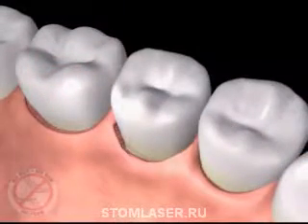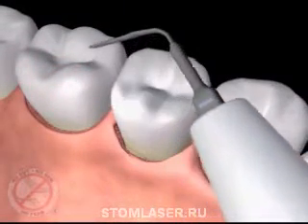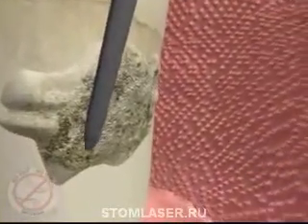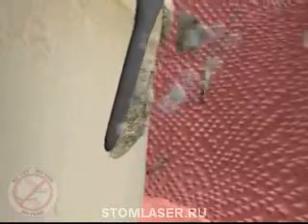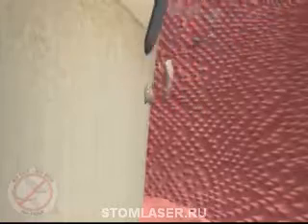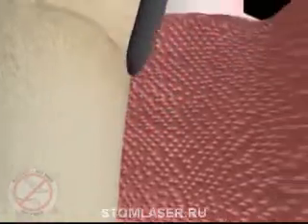The laser tip is then removed from the pocket and set aside. In the next step of the procedure, ultrasonic cleaners as small as the laser fiber tip are used to remove the hard deposits we call tartar or calculus from the top of the teeth and roots. These instruments use sound waves to vibrate and break apart the hard mineral calcium deposits, with water flushing away the debris and cooling the instrument tip.